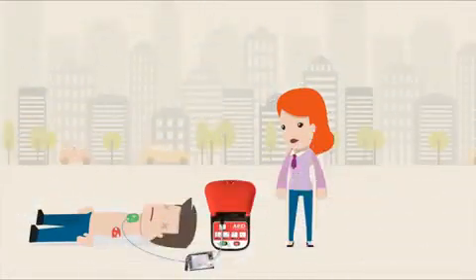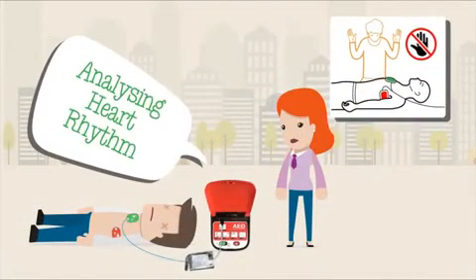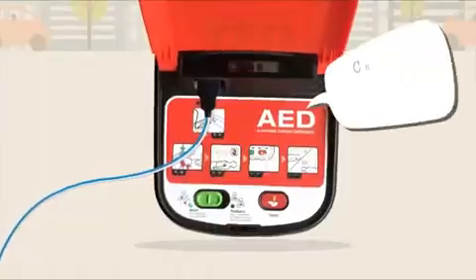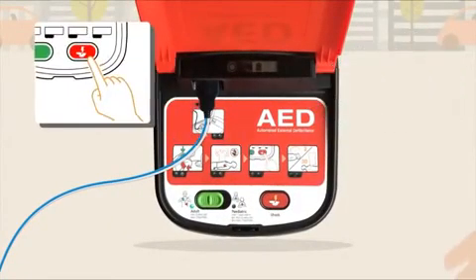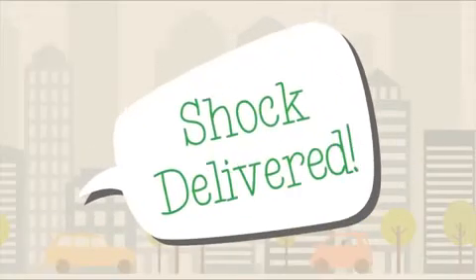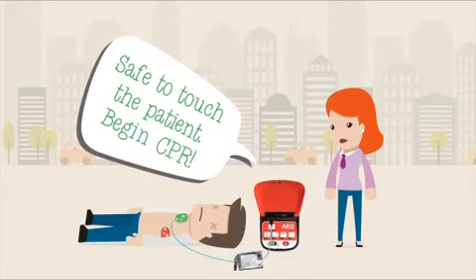Once the pads are applied correctly, the machine will say 'analyzing heart rhythm — do not touch the patient.' If a shock is required, the unit will say 'shock advised, charging — do not touch the patient.' When the AED is ready, it will tell you to press the red flashing button: 'deliver shock now.' The unit will then tell you when a shock has been delivered and when it is safe to touch the patient.